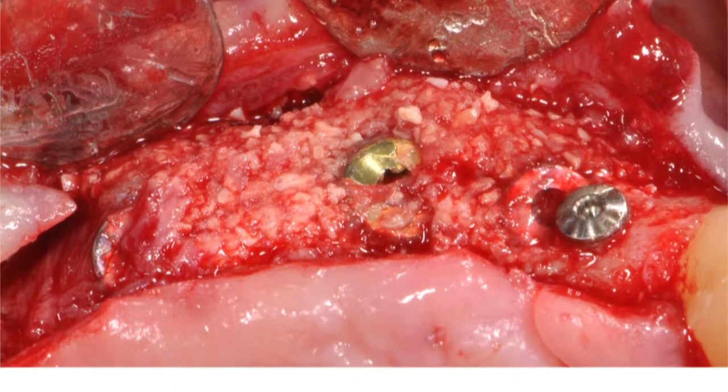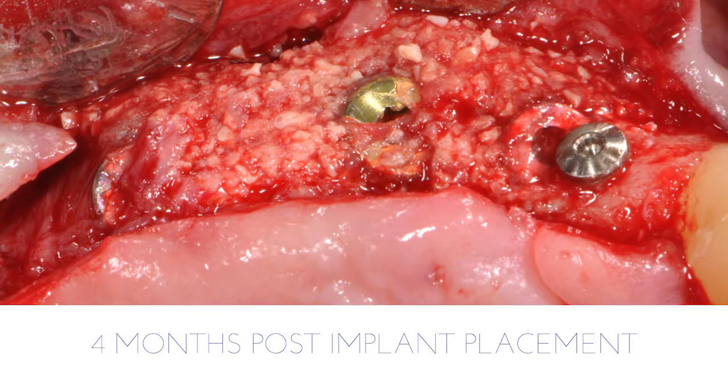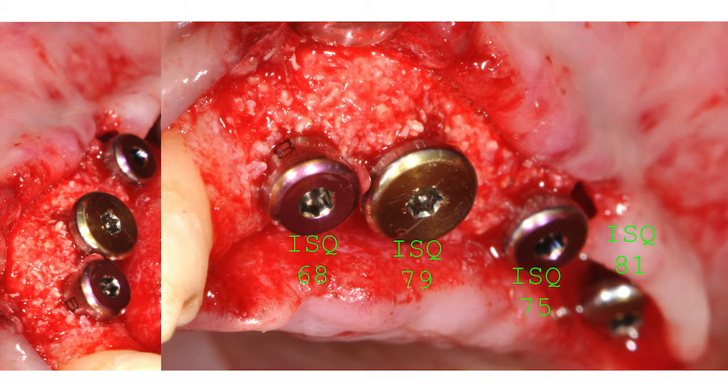So that's at the time of uncovery. I had to remove the pins. I had to remove some bone that was covering also the head of the implant. That's the ISQ value, 68, 79, 75, amazingly 81 where I did sinus elevation.